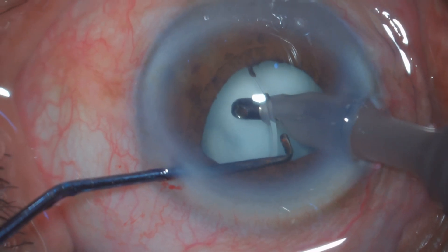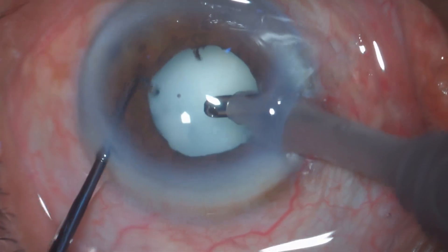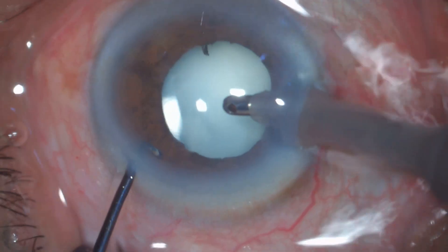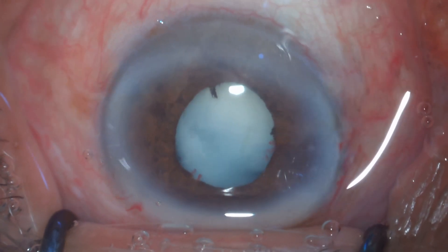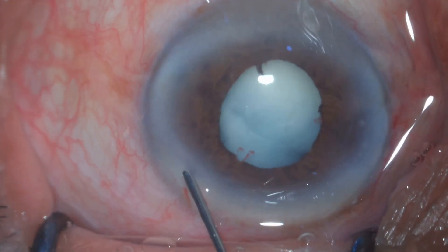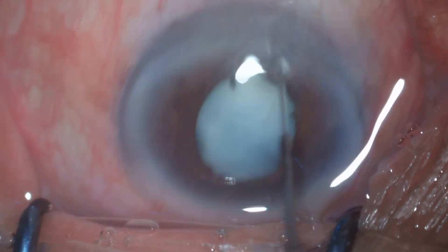Going behind the IOL, removing extra viscoelastic. As there is hardly any cortical matter, I'm just sealing the main port and side port. Again — is the surgery complete, or can I do anything extra at this stage? Open question to all. Thank you.